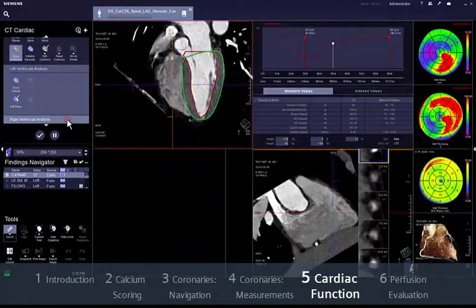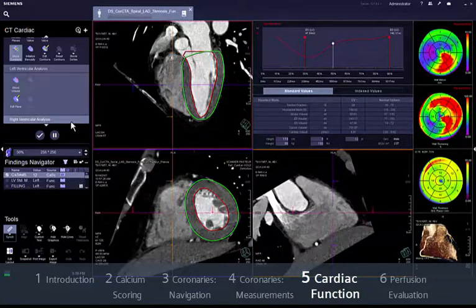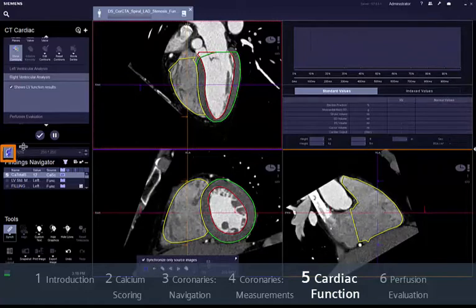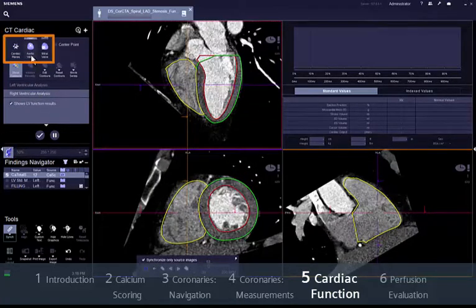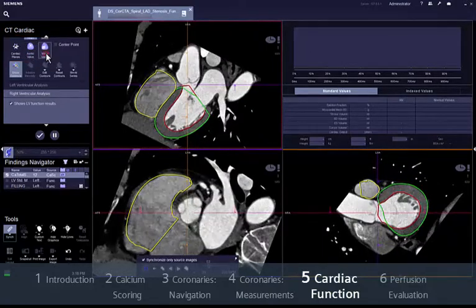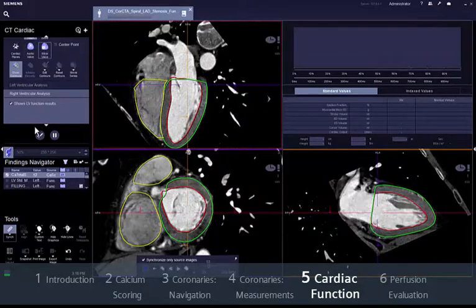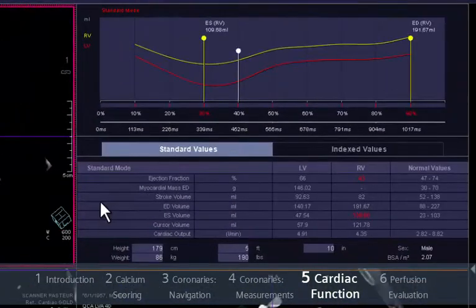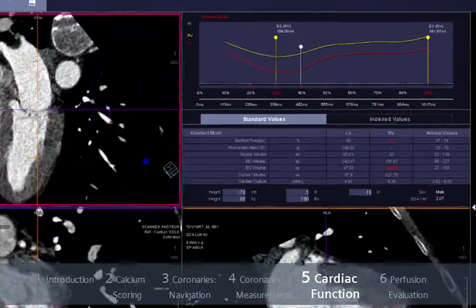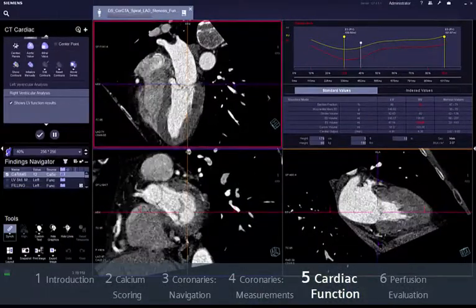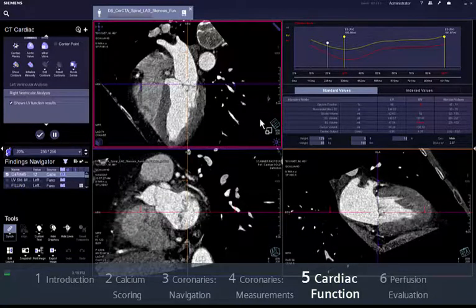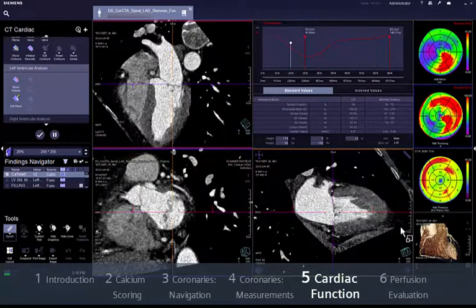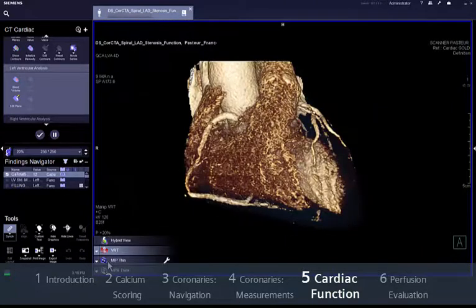In the case of multiphase data, CT cardiac function allows you to read and diagnose CT angiography images of the left and right heart ventricles for the evaluation of cardiomyopathy. The Cine mode and the automatic orientations for standard cardiac planes, aortic valve and mitral valve will help you first make a visual assessment. If quantification is needed, all the relevant parameters such as end-systolic and end-diastolic volume, myocardial mass and ejection fraction are automatically calculated for both the left and right ventricle. Local left ventricular function parameters such as wall motion, wall thickening and wall thickness are visualised in an easy-to-read AHA-compliant 17-segment polar maps, and these results can be visualised in the VRT segment by activating the hybrid view in the lower left corner menu.